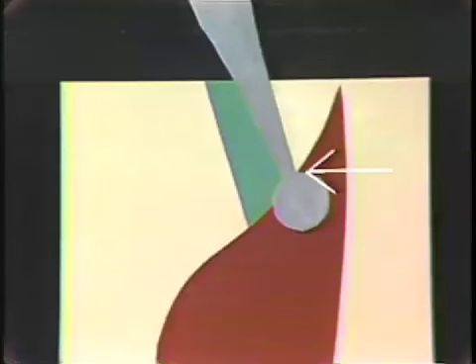Now that the burr is in the pulp chamber, we want to unroof the pulp chamber working from the inside out. With the burr not running, we want you to feel around the anatomy of the pulp chamber a bit, just so you'll make sure that you know where the roof is and unroof that, as opposed to gouging the walls. So you can stick the burr a little bit farther down, feel where the walls are, run the head of the burr against the walls with the handpiece off. As you withdraw the burr from the channel that you made, you'll hit a bump as you hit the roof of the pulp chamber. When you feel that bump, you know that that's where the pulp chamber starts.